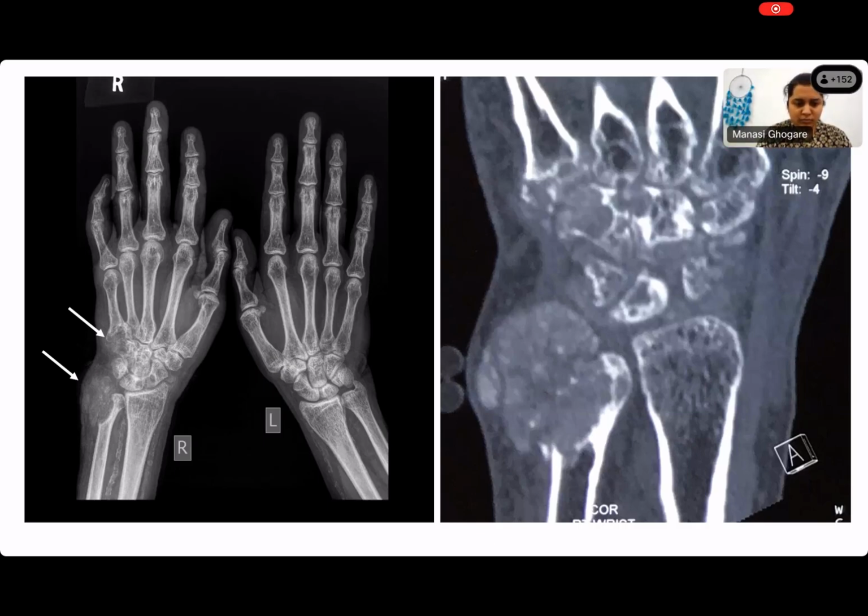All right. Now let me ask some of the others. Monica, do you agree with Mansi? Do you agree with both her statements, that on the left-hand side there is a plain X-ray and on the right-hand side is the CT scan? Yes, ma'am. Let's ask Sarangi. On the right-hand side it is the CT scan, and the left-hand side it is X-ray. Prayas? You also agree. Very good. Hema? You agree. My God, you're all yes men and women. Zara? Yes, ma'am.